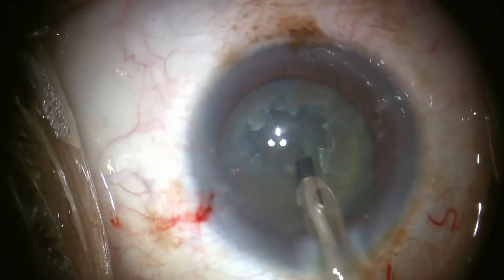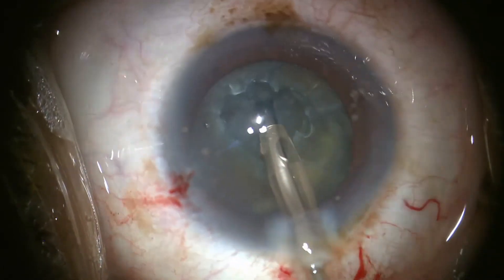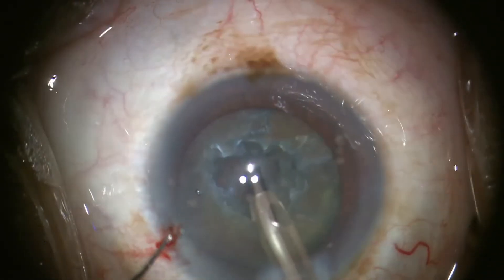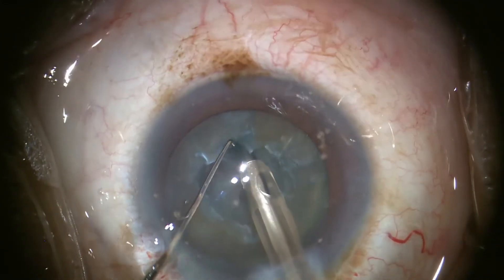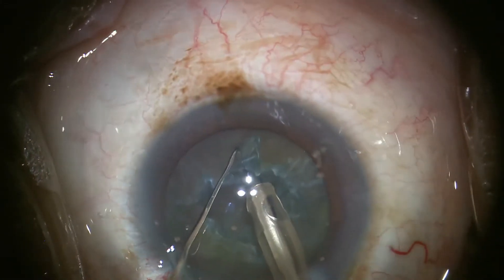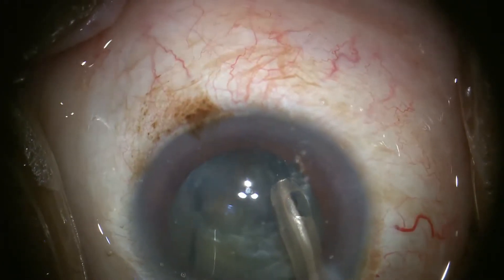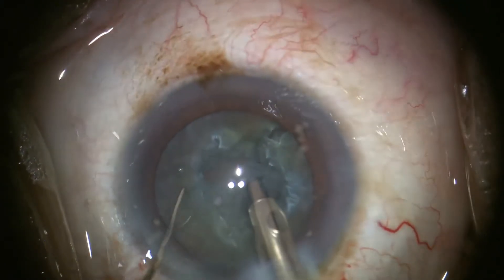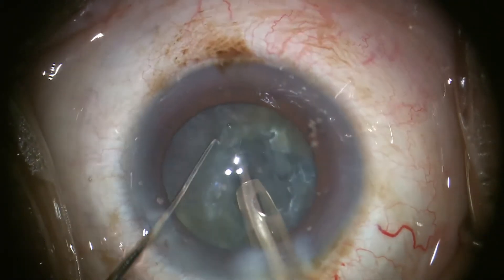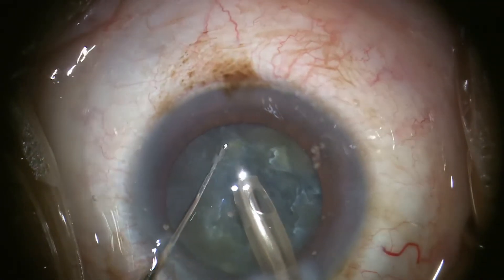In lenses with greater peripheral density, it works better to increase the diameter of the bowl. A Szynski hook is placed in through a paracentesis opening. This section of video is shown unedited so one can view the entire process of creating the petals. A chop setting with high vacuum, low flow, and only longitudinal ultrasound is used while burying the tip into the pericentral nucleus at mid-height on the bowl's wall.